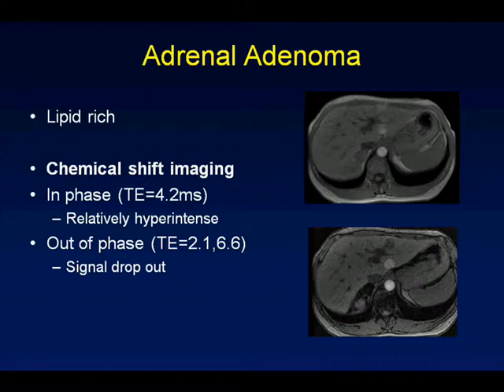In terms of adrenal imaging, trying to characterize whether a lesion is an adenoma or not, CT actually does quite well. You can characterize the lipid-poor adenomas with washout, but certainly a Hounsfield unit on CT of less than 10 is diagnostic for adenoma, and you can pretty much stop there. So the role of MRI in characterizing incidental adenomas isn't as common as it used to be. But if you incidentally have a patient with an adrenal lesion, you can quickly do in and out of phase imaging, which will depict microscopic fat, a feature of adrenal adenomas.